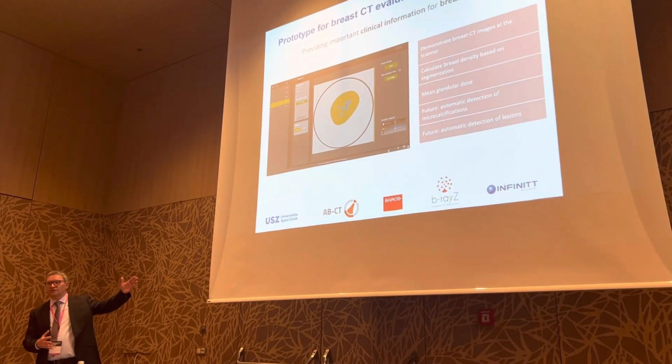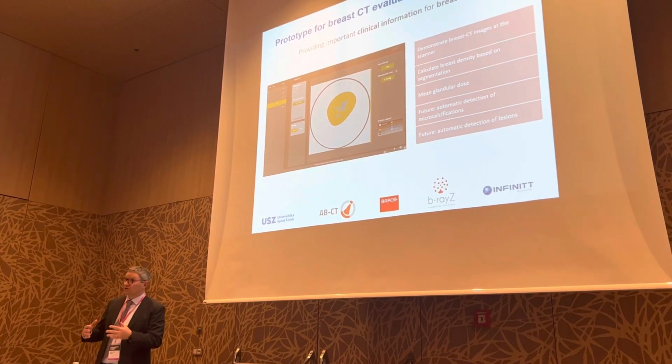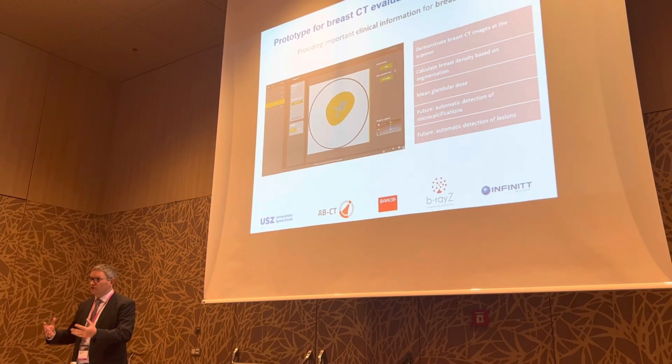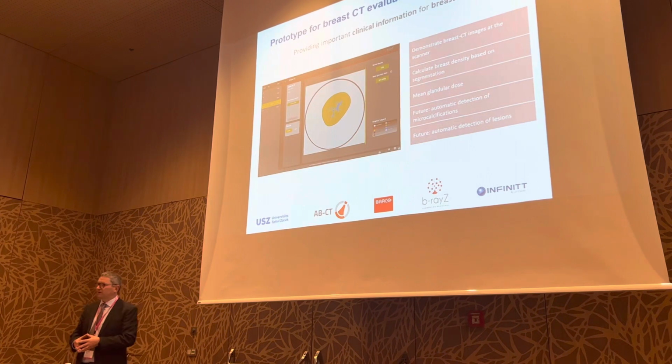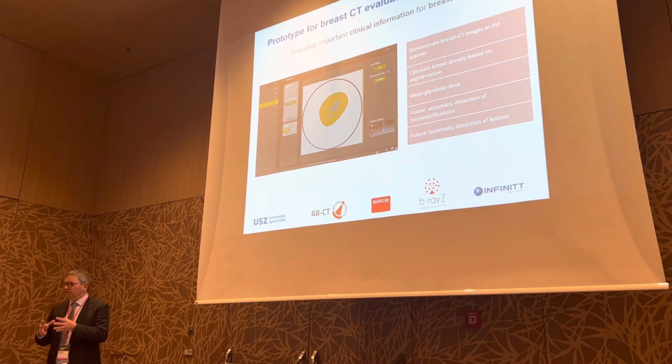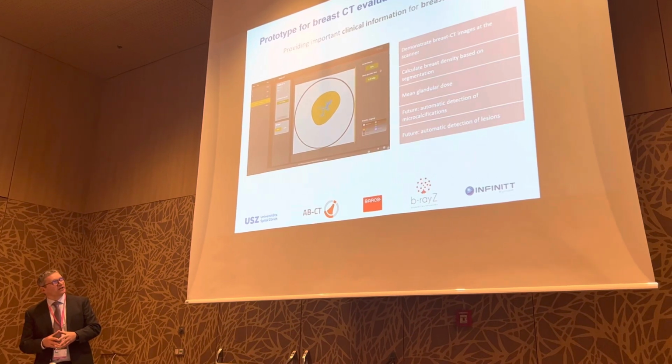You can look at the segmentation of the breast tissue, which tells you that reliable dose values are calculated. Only if you segment the glandular tissue will you get reliable dose values.